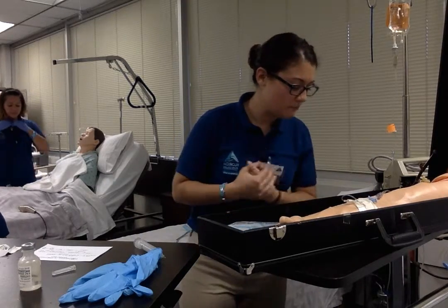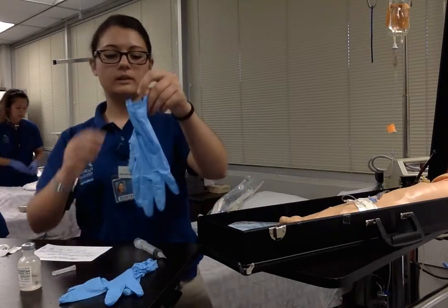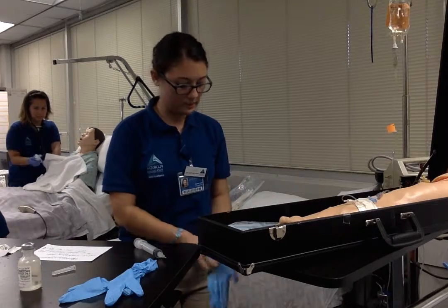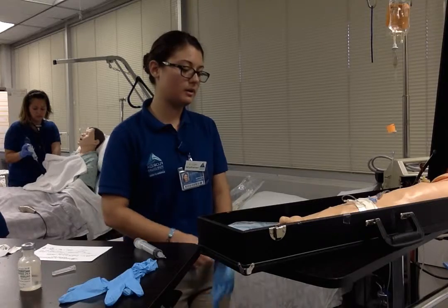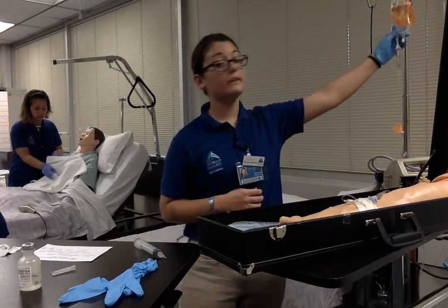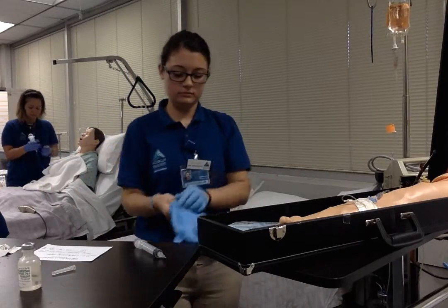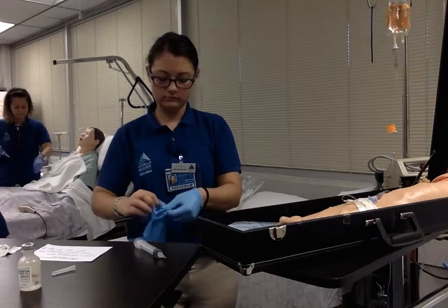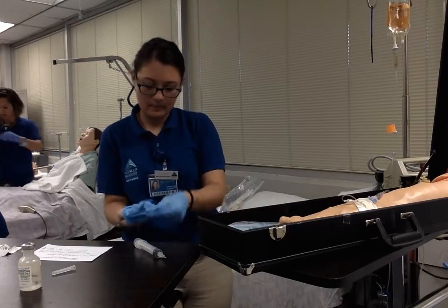I'm going to go ahead, I'm going to wash my hands again, and go ahead and put my gloves on because I'm going to get ready to add this piggyback to the primary line that we already have hanging here. I'm now going to irrigate it with 30 ml of saline.